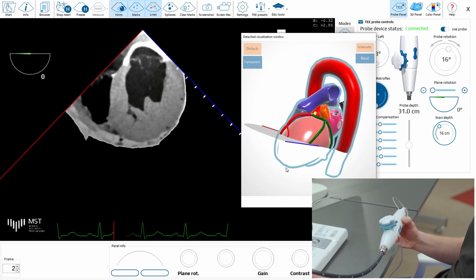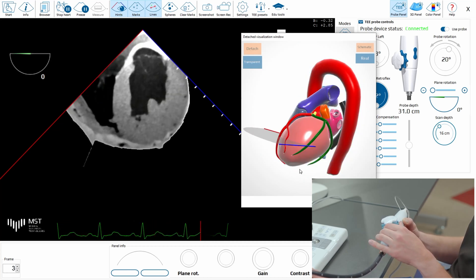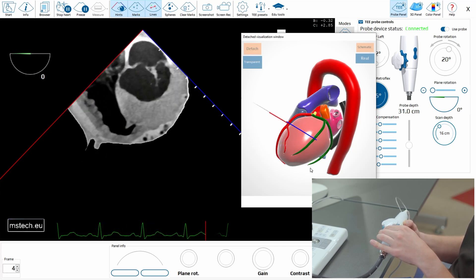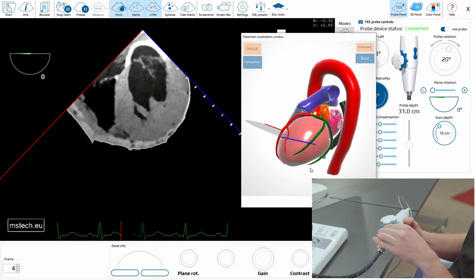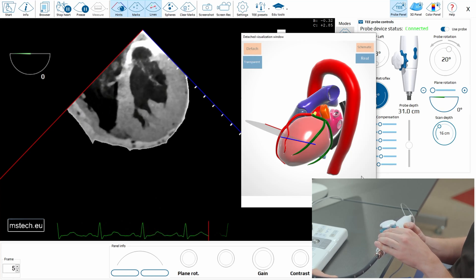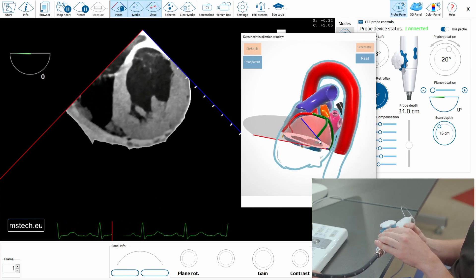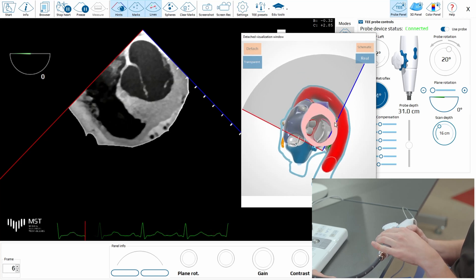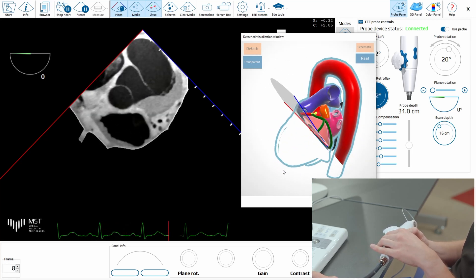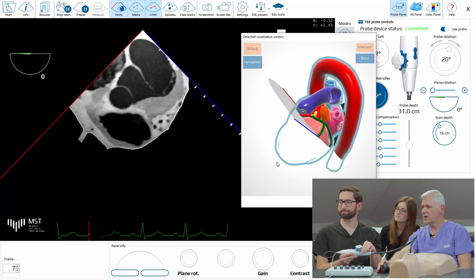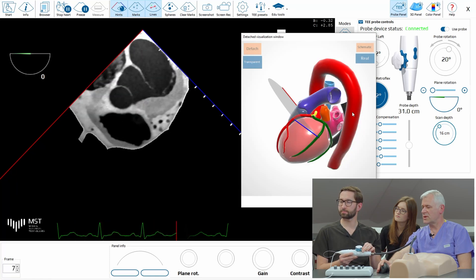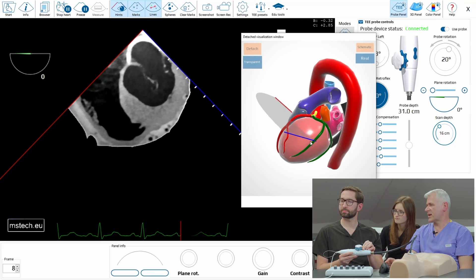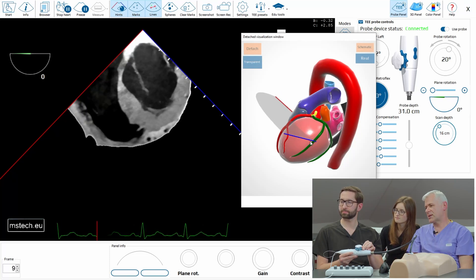So what to do? Flex a little bit. But the question is retro or anti-flex? You have to section the ventricle — you want to be more perpendicular to the long axis of the left ventricle in this case.